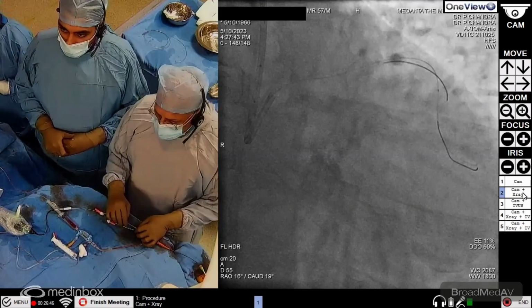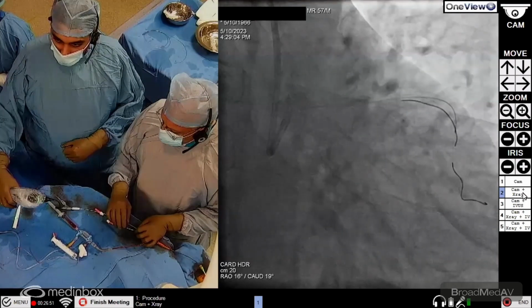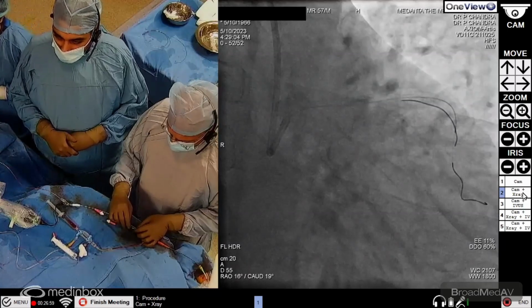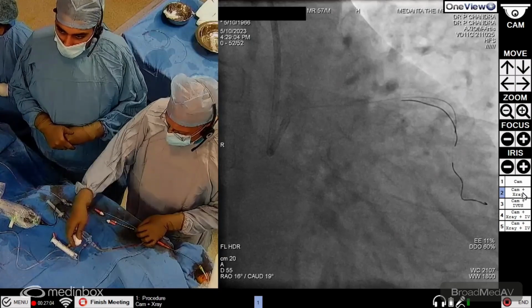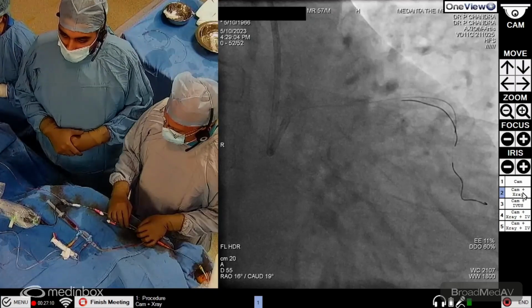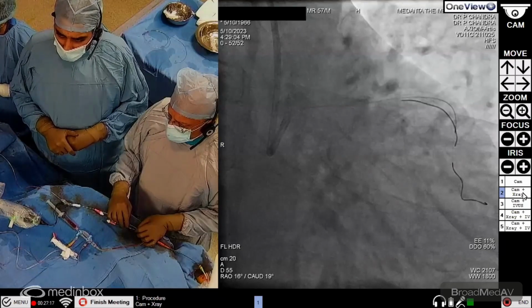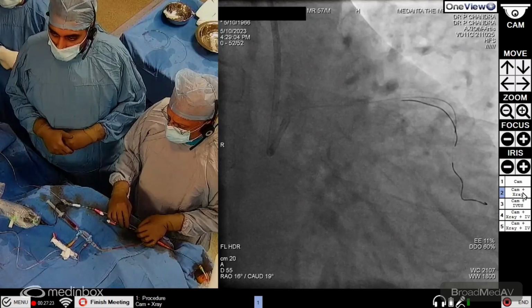So our patient is a 57-year-old gentleman. He presented with effort angina from the last 1 month, which was revealed on TMT, the stress test, which showed a wall motion abnormality at peak stress. He also has a comorbidity of chronic liver disease, for which he is already on treatment by a gastroenterologist, although his platelet function and platelet counts are low. After due clearance from the gastro and the hemat team, we are proceeding with his angiography.